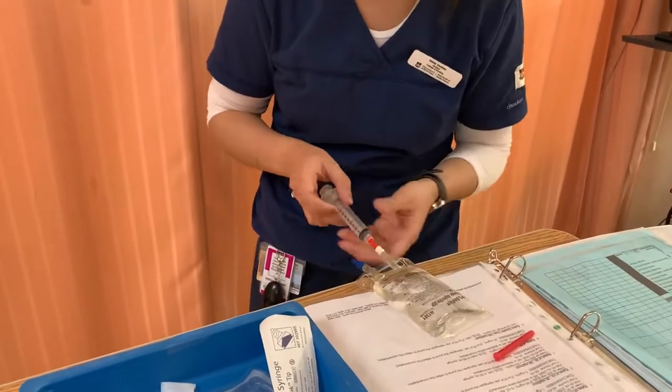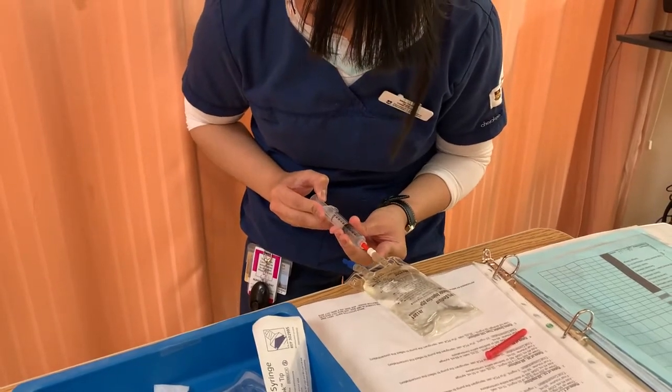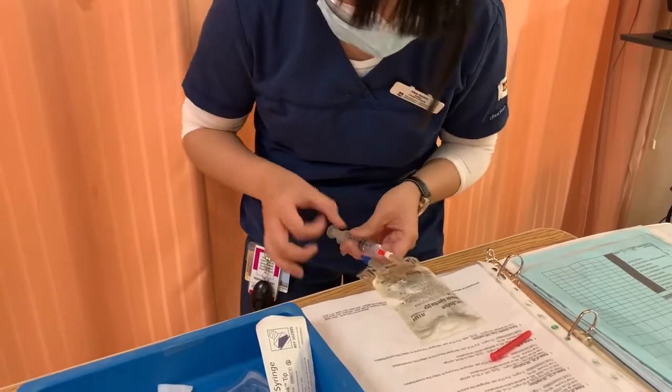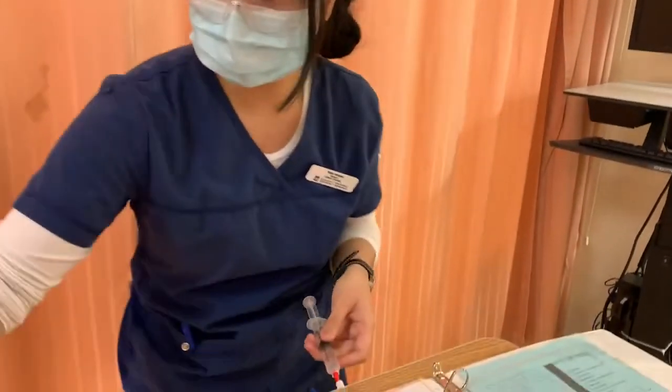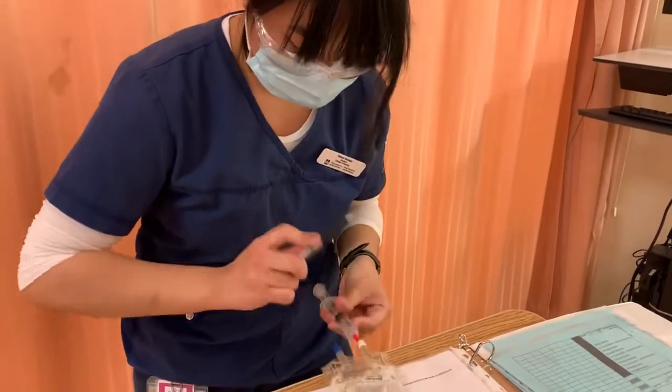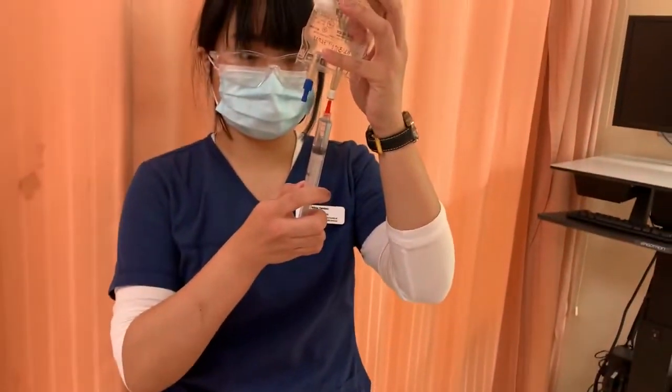So nothing touched that port so I can access it. Just gonna take my 5 mLs right here. There we go. Gonna take out the excess air bubbles. What's the time? 2 minutes 44 seconds. Okay. So I'm just gonna put that in there.